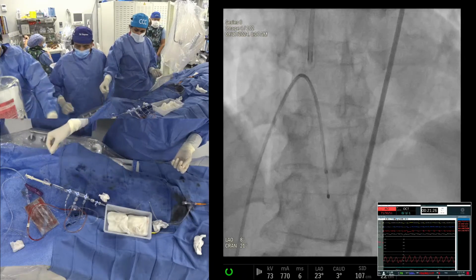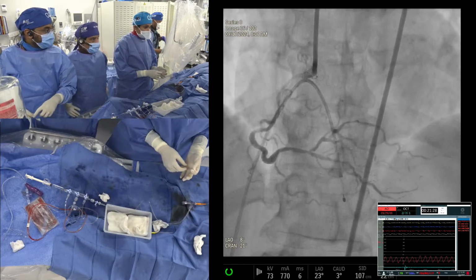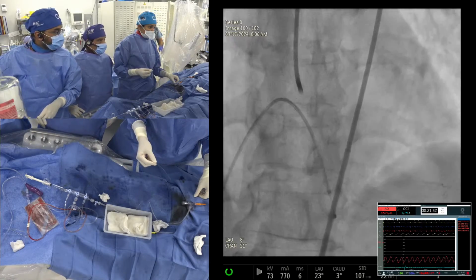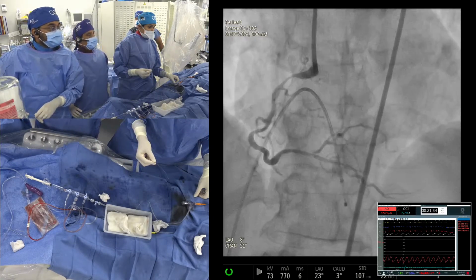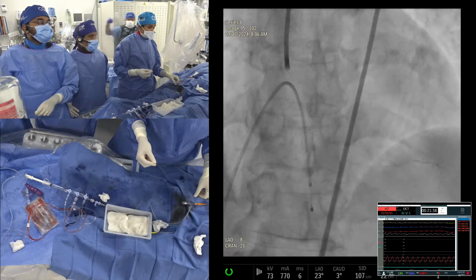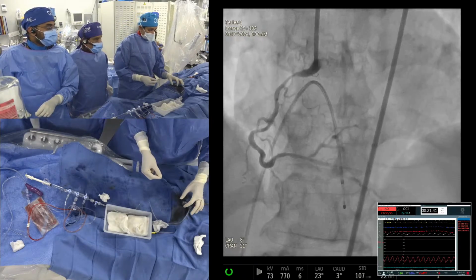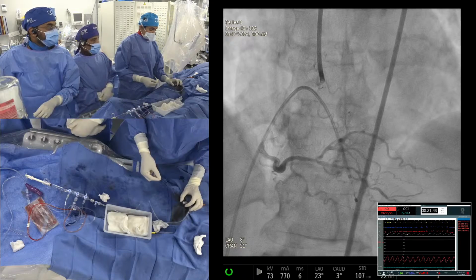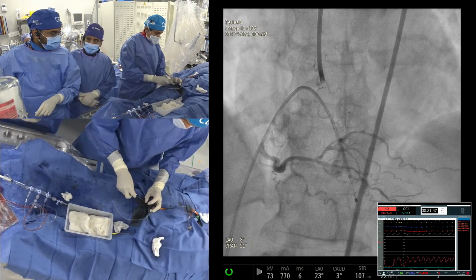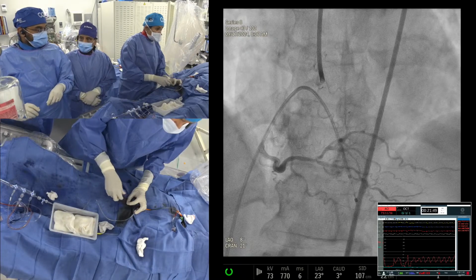You mean the bifurcation? Yeah, look at it, calcified there, and maybe we can avoid the PDA, very angulated, in the mid 70%, but definitely the large or medium size RPL AV continuation, put a PTC and stent. So the question is the distal RCA with the 1.5 burr.